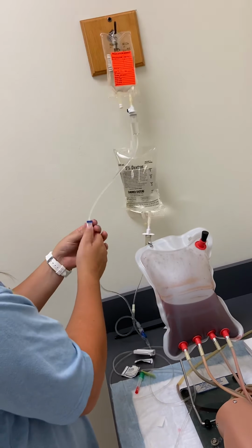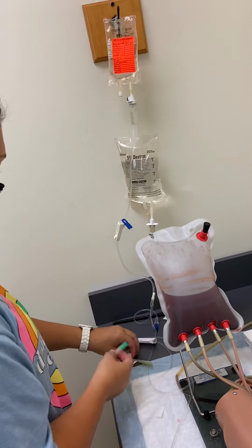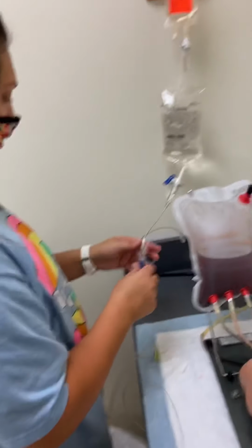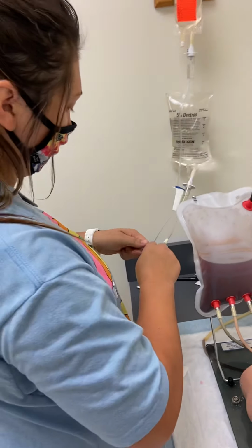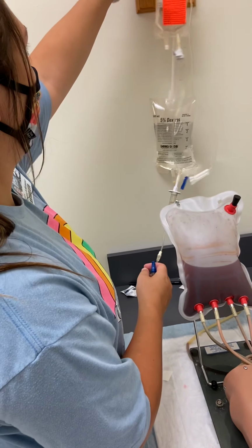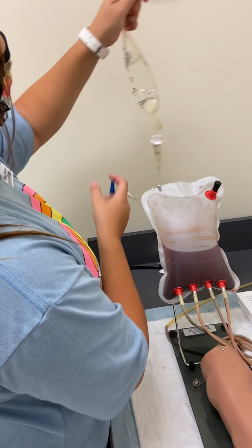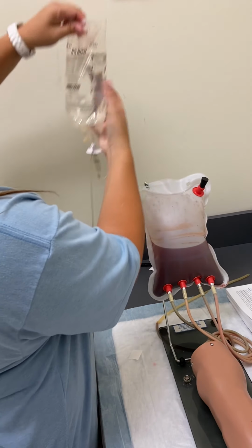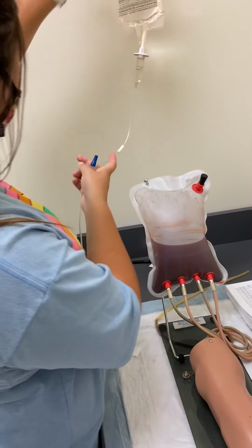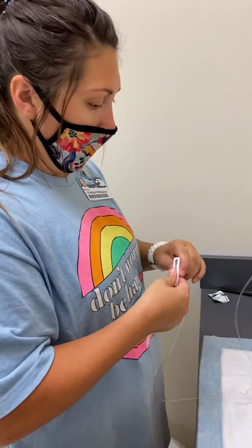So I'm going to clamp it off that way I don't lose anything. Take this out. Dispose of that. Lift my primary back up. And then I would re-regulate it by my drops a minute right here. And that's it.